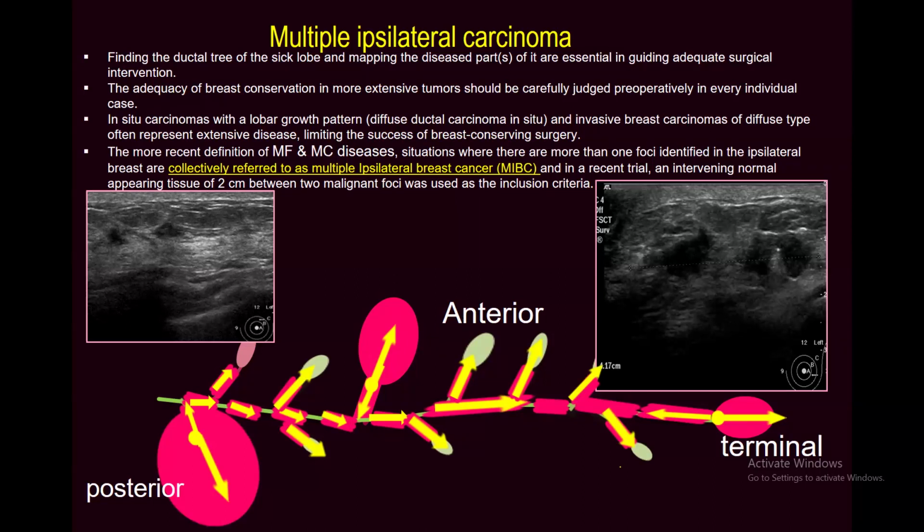If it is in different quadrants, multicentric. But the recent definitions collectively refer to both as multiple ipsilateral breast cancer, MIBC.